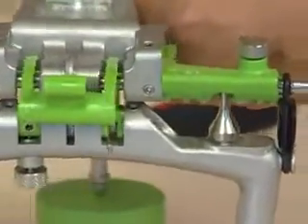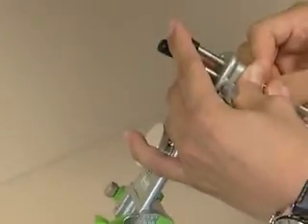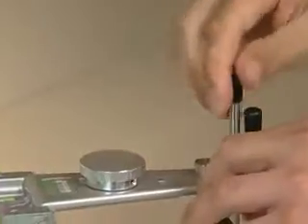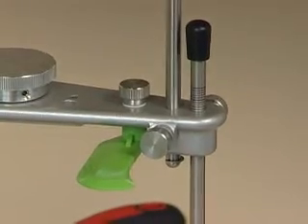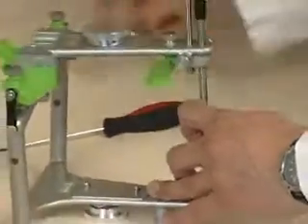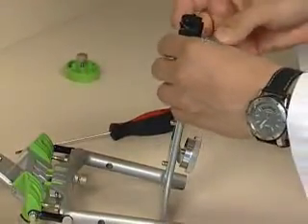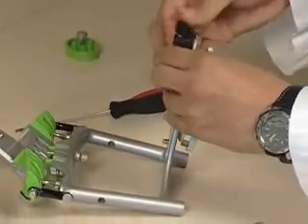We want to set the incisal guide pin so you just barely see the green mark, which means that the upper member of the articulator now will be parallel with the lower member of the articulator. And the next thing we have to do is change the incisal guide table and put in the mounting table. Be sure and slide the mounting table all the way back until it makes contact with the bottom frame of the articulator.